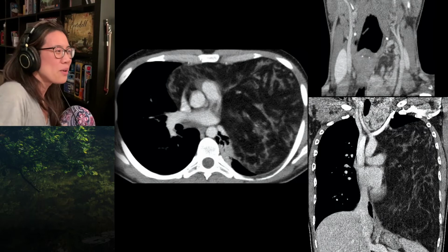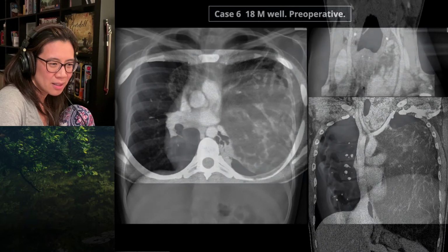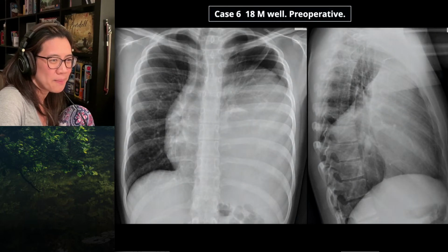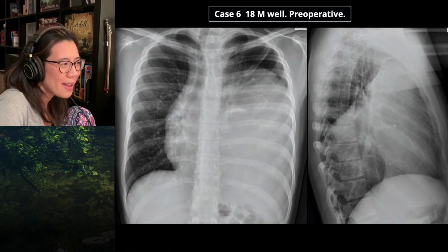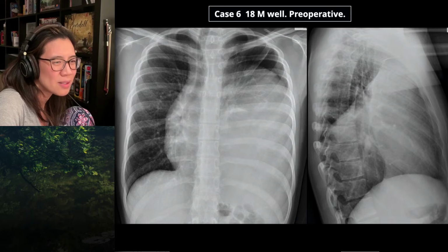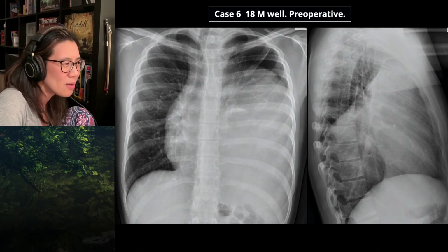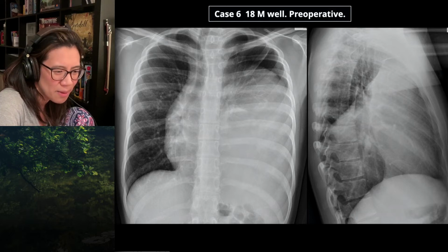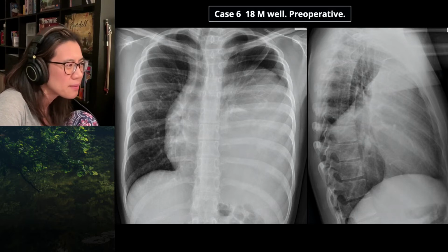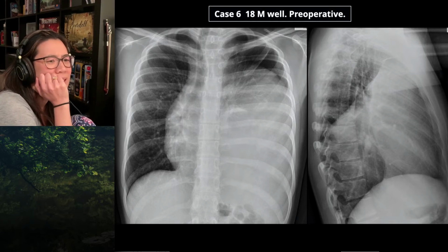Wow. So can I just go back one? I'll just go back to the chest x-ray, because I was going to say that for such a large thing, it's dense, but it's not super. Am I on the wrong track here? Am I cheating now that I've seen this X-ray? I think you're cheating because you're seeing it, but you're right. It's not super dense.